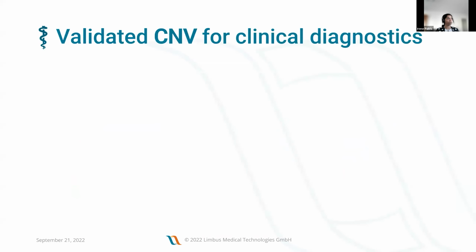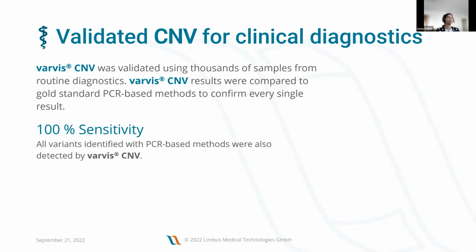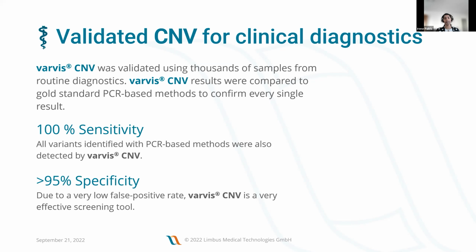Now, our CNV pipeline has also been validated using thousands of samples from routine diagnostics, and the results were compared with PCR-based methods. What we saw was 100% sensitivity when compared to PCR-based methods, and greater than 95% specificity.